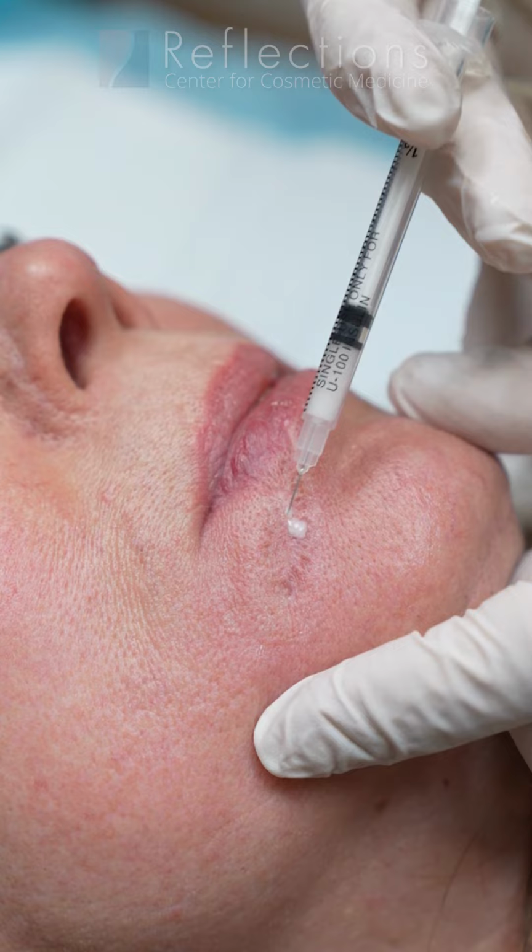So what we're about to do is to treat scar formation on the right side of the face. And this scar is from many years ago, but still with lasers today, we can make a dramatic change in scar formation. We're going to use a couple of different things to make this scar better. Number one, a laser called an ablative laser, or the Fraxel Repair, which is an aggressive laser to try to reduce the thickness of this tissue.